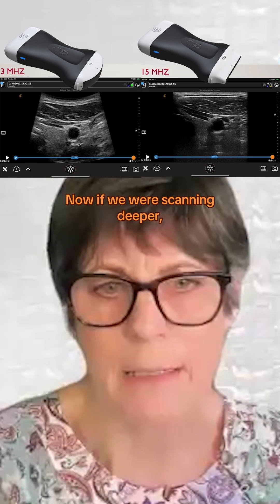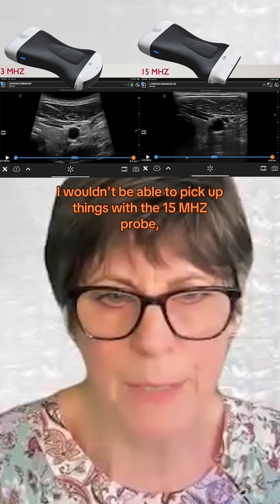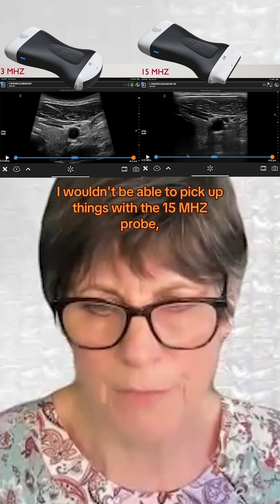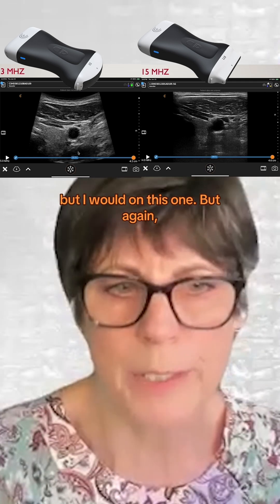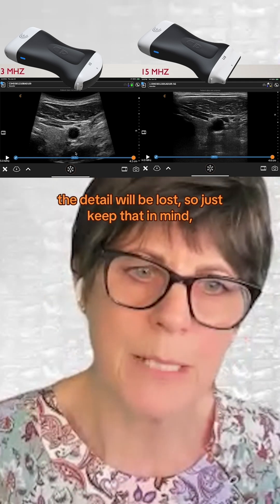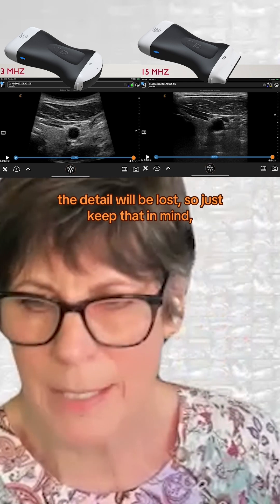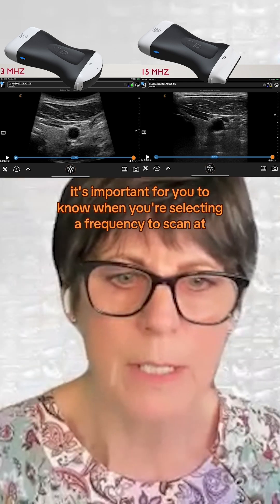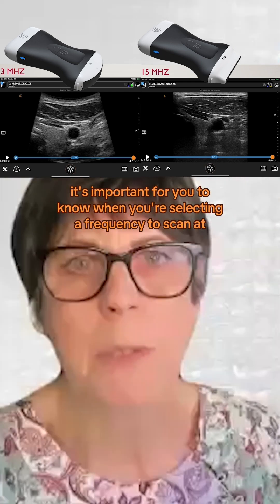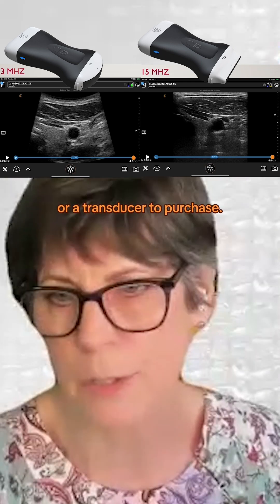If we were scanning deeper, I wouldn't be able to pick up things with the 15 megahertz probe, but I would with the lower-frequency one — though the detail will be lost. So keep that in mind. It's important for you to know when you're selecting a frequency to scan at or a transducer to purchase.